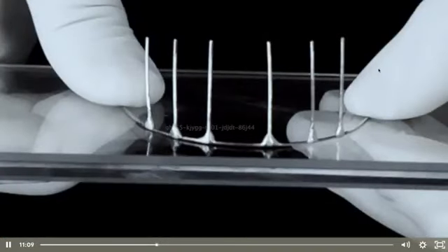And here I'm going to show you the way I apply the torque, and I will compare it with another way to do this, which we see very frequently on YouTube or other media. People apply the anterior torque thinking they are applying a good, real torque, but in fact they are not applying a real torsion in the anterior segment. They are just twisting the wire between the anterior segment and the posterior segment, but the anterior part of the wire remains untorqued, with no torsion in this anterior part.